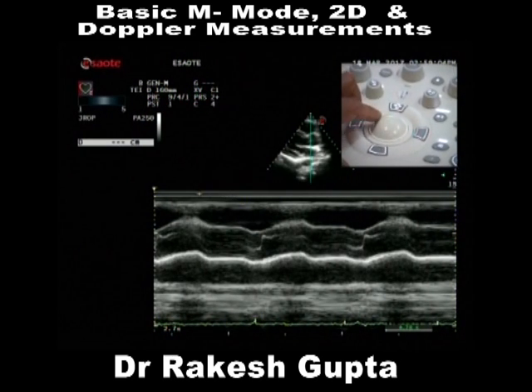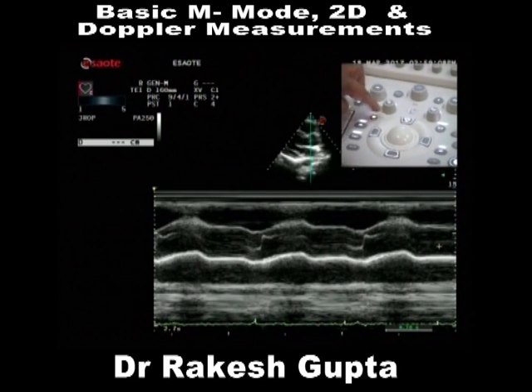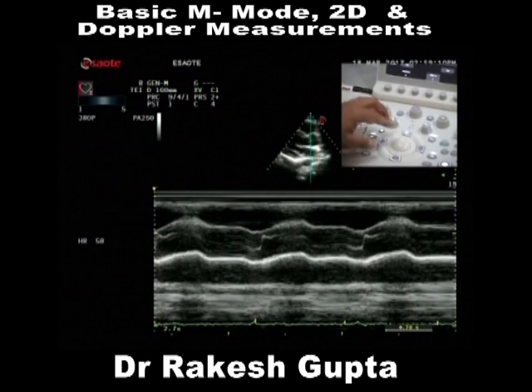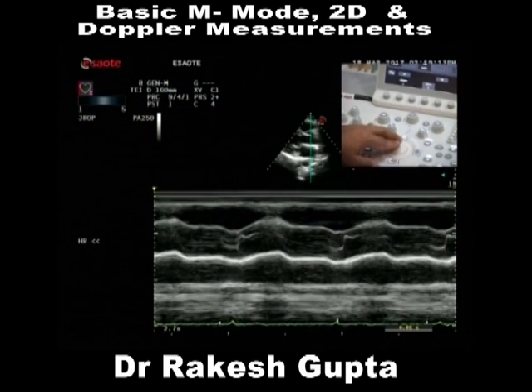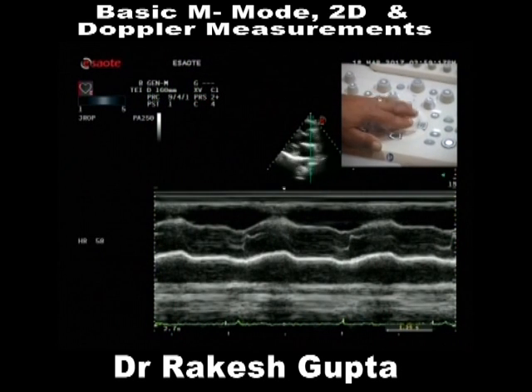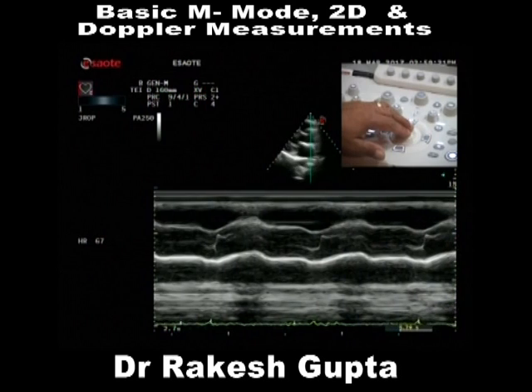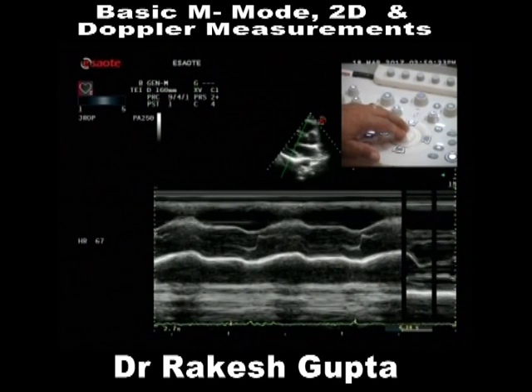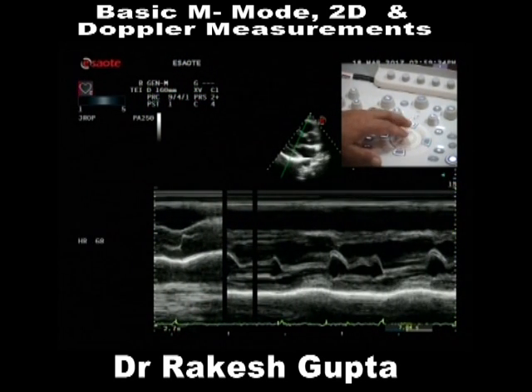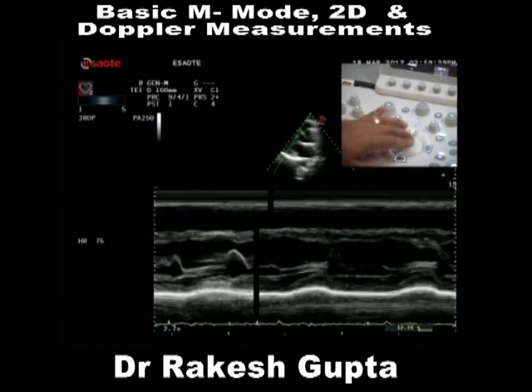Now once I scroll this, look, this image will start moving. I'm scrolling now. Now this cursor will go to the tip of the mitral valve leaflets. So the mitral valve will open up. Now this cursor is distal to the tip of the mitral valve. Now the LV will come automatically.